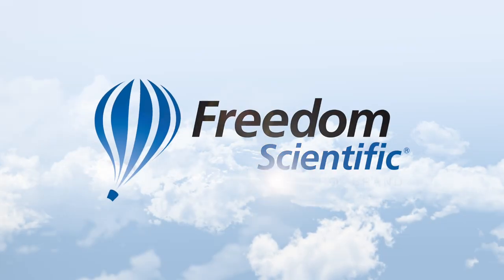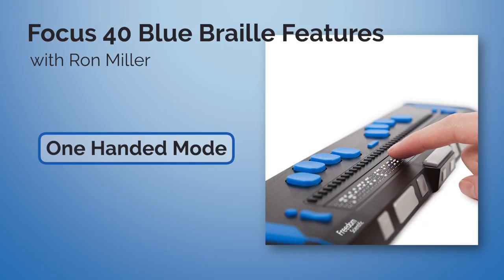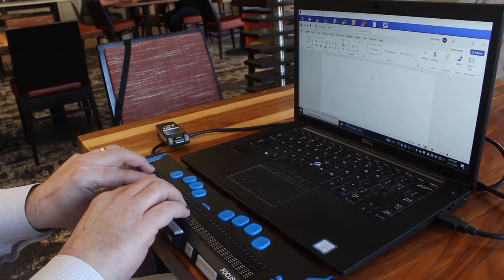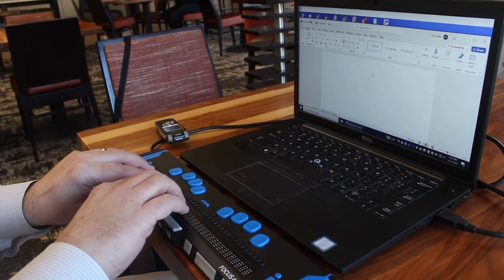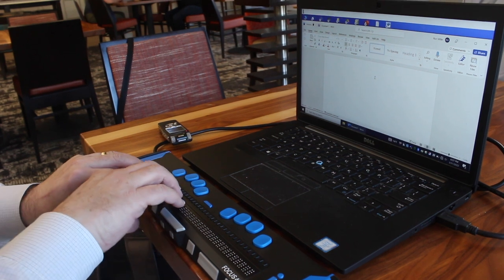Freedom Scientific, a Vispero brand. One of the new features we've just introduced to the Focus Blue Braille display line is one-handed mode. This has been a feature that a lot of people have requested over the years, and we're finally able to incorporate it into the Focus Blue's firmware.